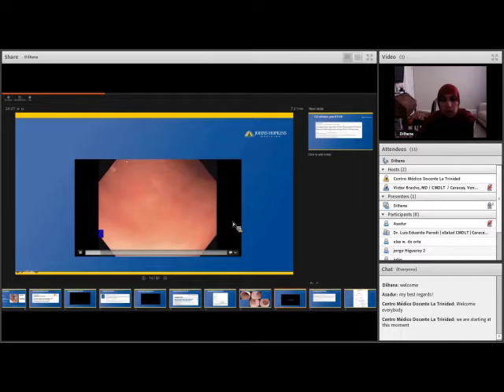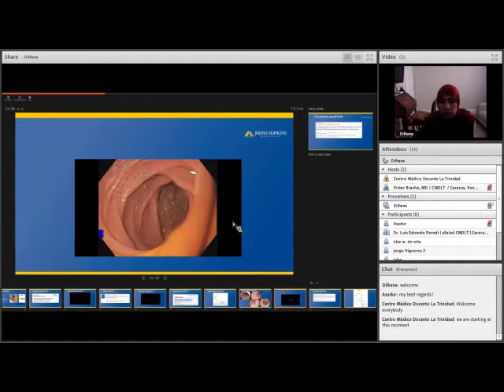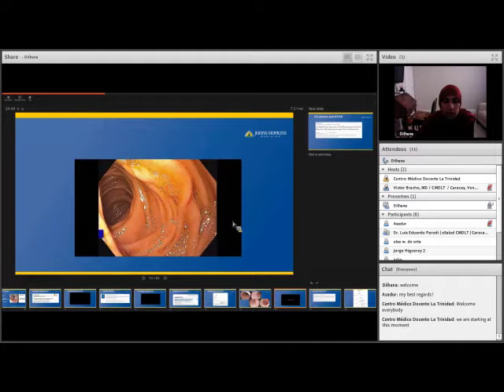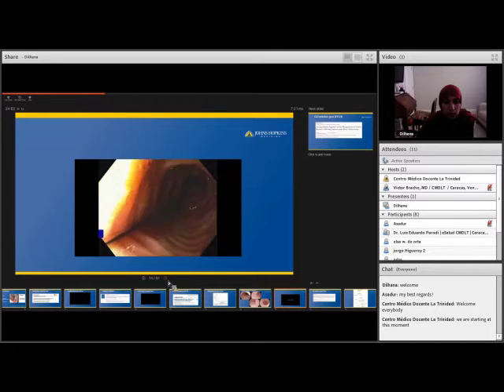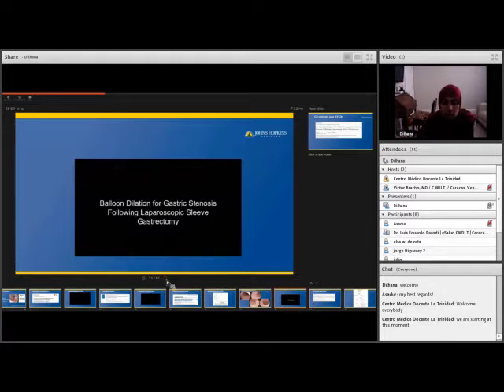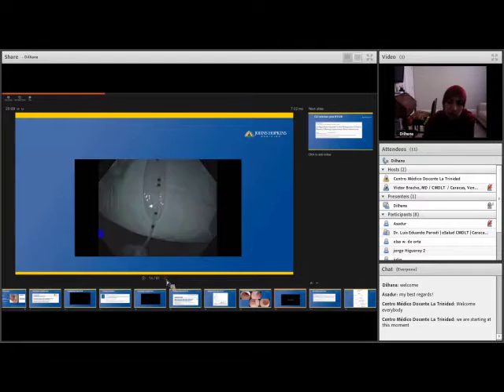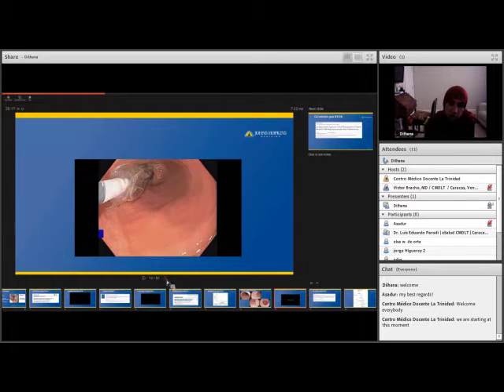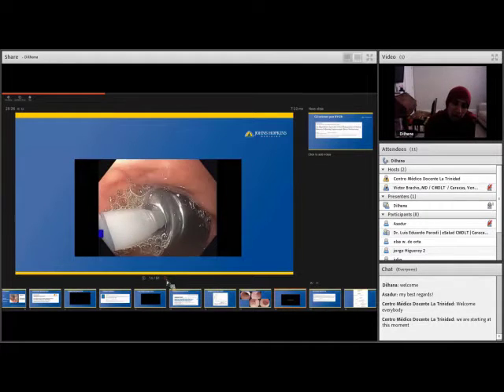So what we do for these patients is that we dilate the sleeve. And I'm going to play this video for you here of a balloon dilation, which you can see we're introducing the endoscope now. And you can see here again, there is this tortuosity right here with a narrowing. And we're going to go all the way into the duodenum. And now we are going to pass the catheter so that we can pass the balloon over it. And then right at the gastric stenosis, you're going to introduce the balloon and you're going to dilate.